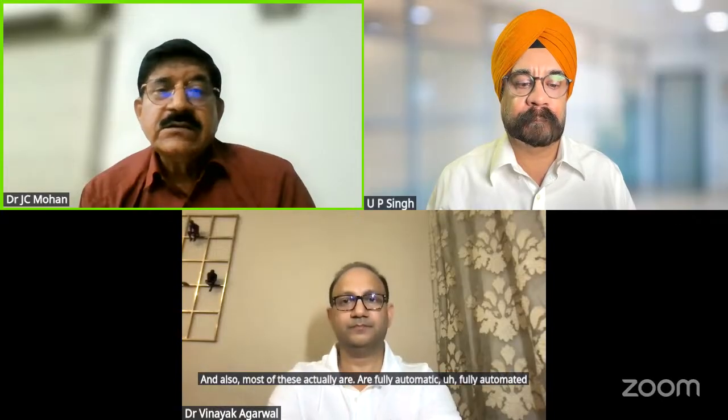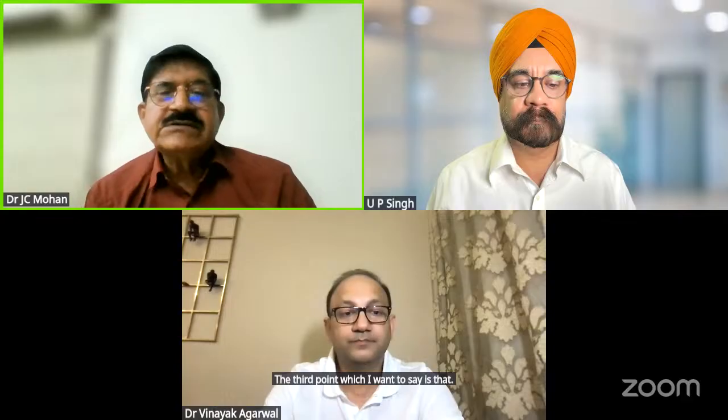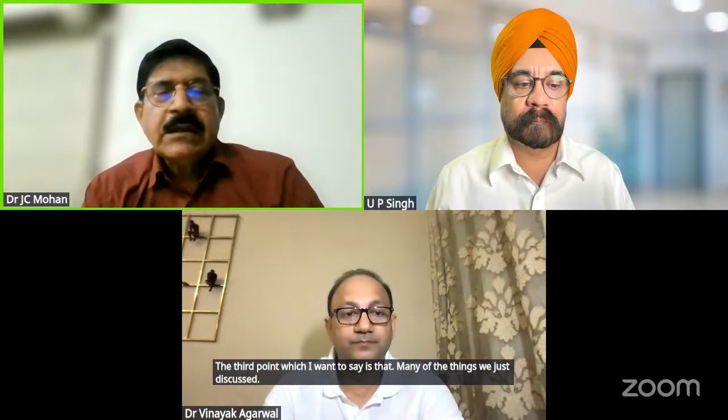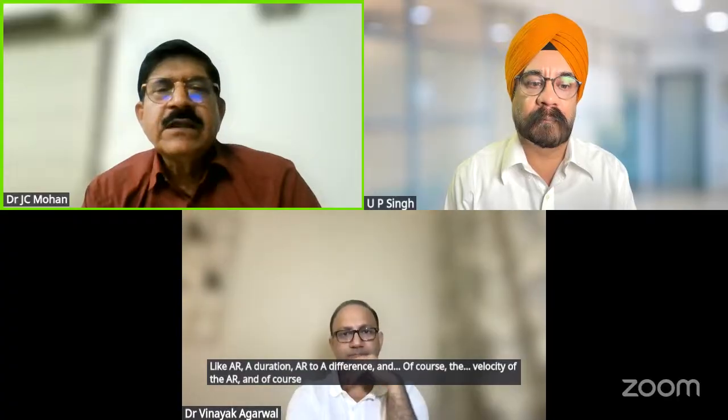The third point which I want to say is that many of the things we just discussed, like A duration, AR to A difference, and of course the velocity of the AR, and of course Valsalva and things like that, in practice, we don't do it.